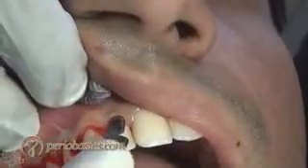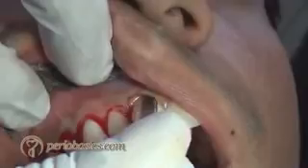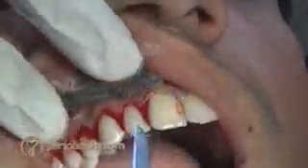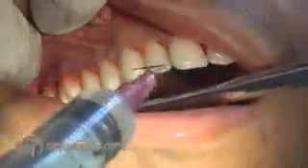And this is how we complete the first incision. You can see the incision line clearly now.